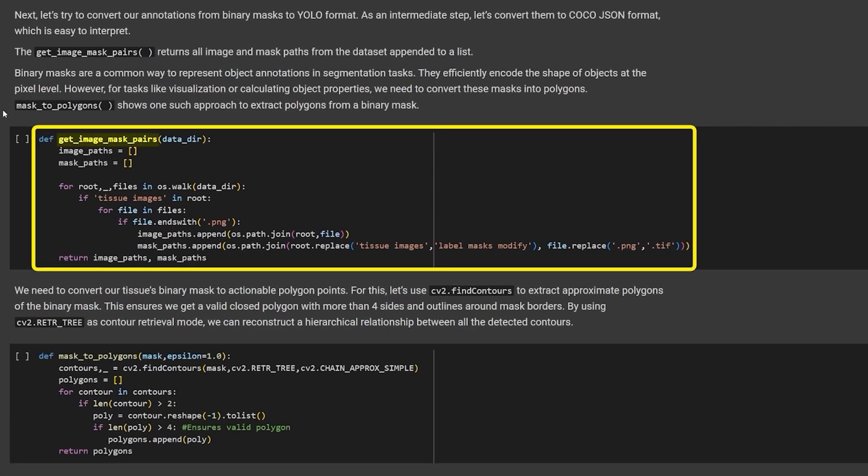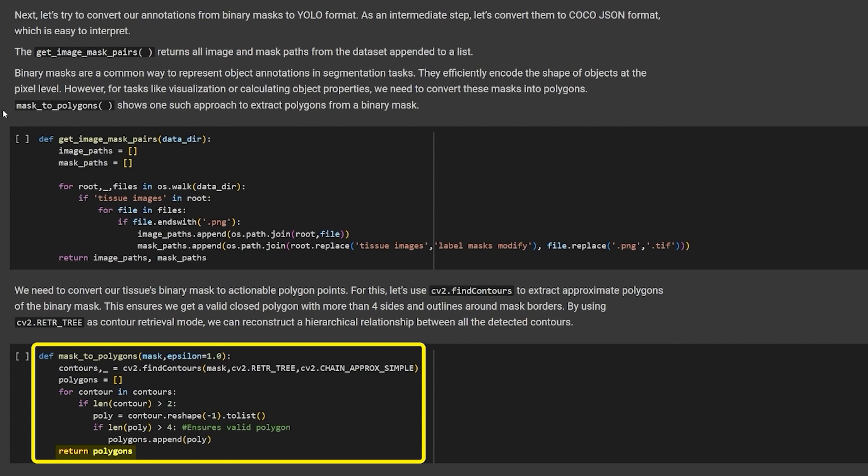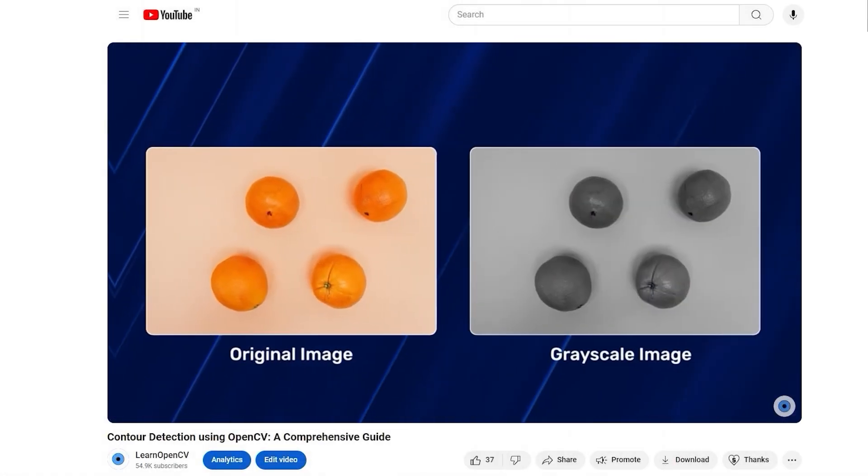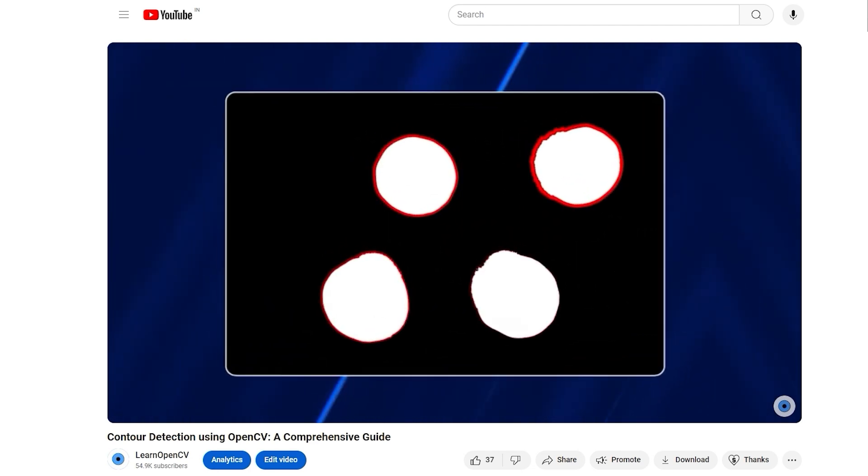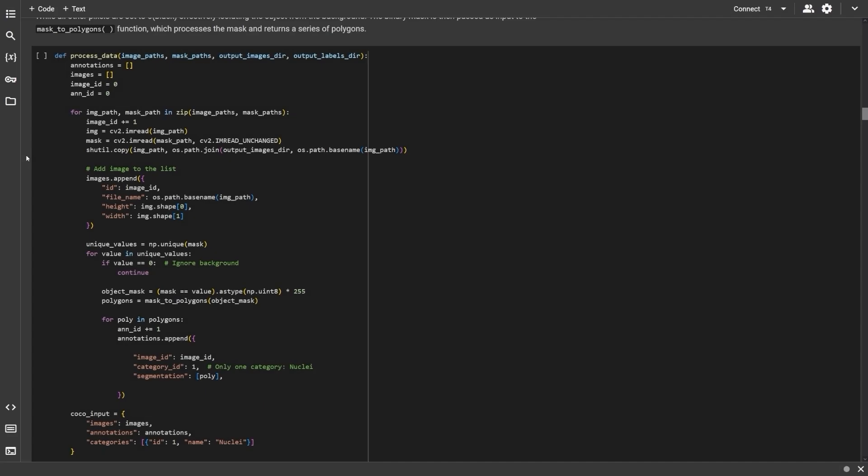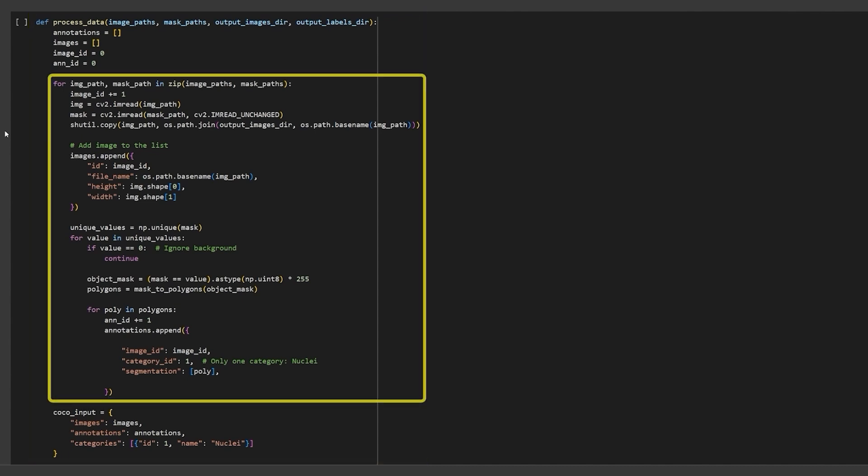The function getImageMaskPairs returns the image path and its corresponding mask path as a pair. Then the function maskToPolygon accepts the masks and applies contour detection to the image to get the annotations. We discard the invalid contours and return a list of only the valid contour coordinates, i.e. the X and Y points of the contours. Check out this video to know more about contour detection using OpenCV. In the processData function, we import the image and mask paths and the output image and label directory. This function will convert the annotations to YOLO format.